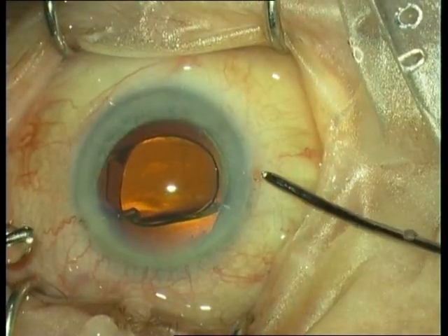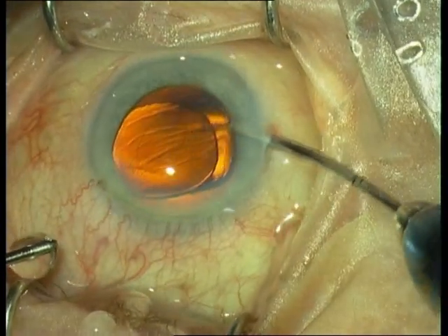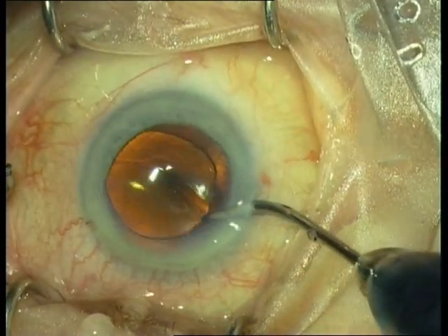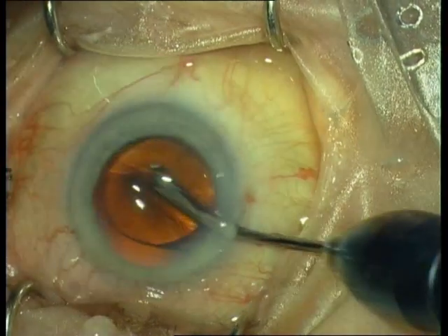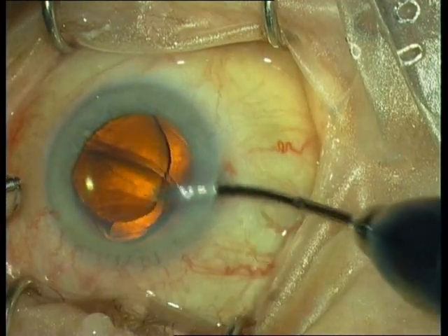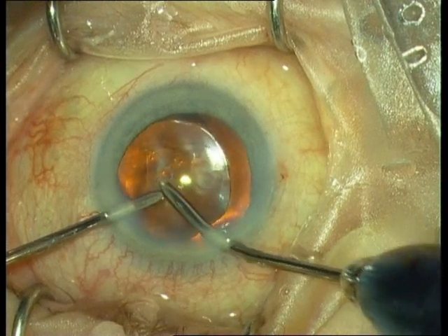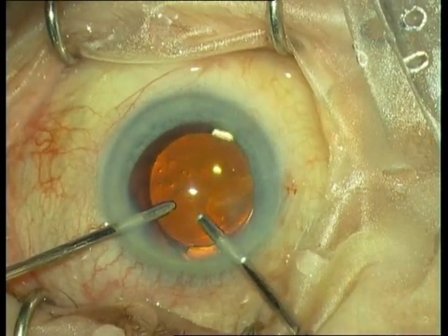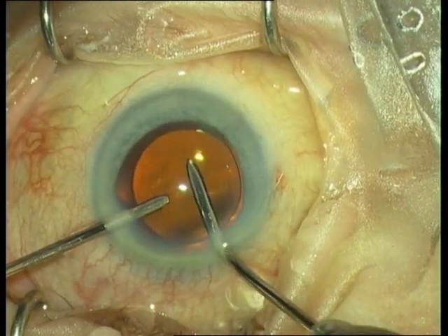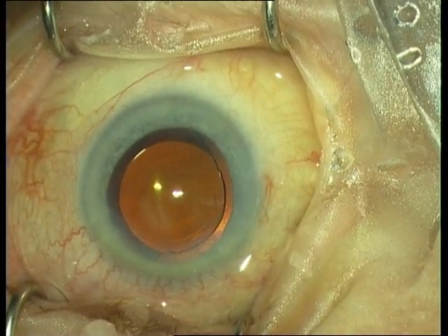Especially for the three-piece IOL, the first haptic should come to lie inside the capsular bag. With one piece it is actually easy either way. But always double check that both haptics are inside the capsular bag and not inside the sulcus. Confirm the upper haptic is in the capsular bag, not the sulcus.